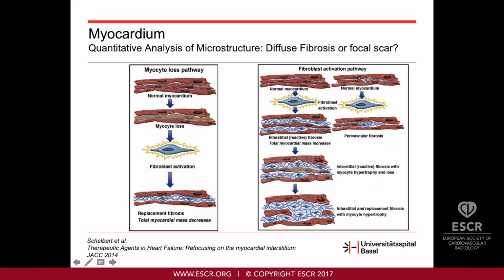Because if we see myocardial damage with echocardiography as a functional abnormality, this is damage already at a pretty advanced stage. Whereas with MRI, with late enhancement, we can identify myocardial fibrosis, diffuse myocardial fibrosis, and then modify chemotherapy. So I think this will be a very helpful application to guide therapy in patients receiving chemotherapy.